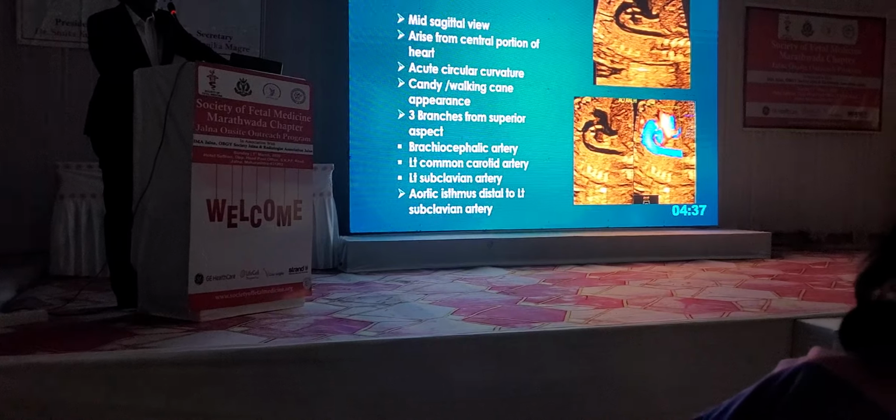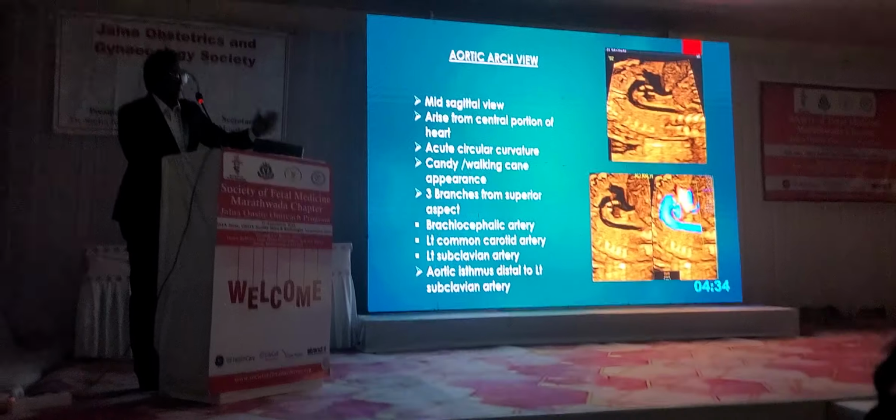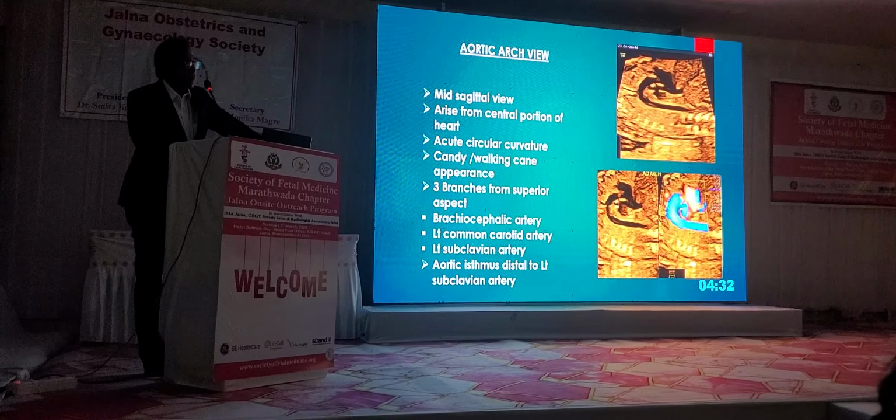Aortic arch. This is the mid-sagittal, almost slightly to the left, view you will get.